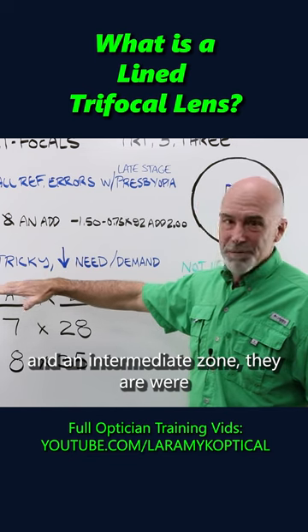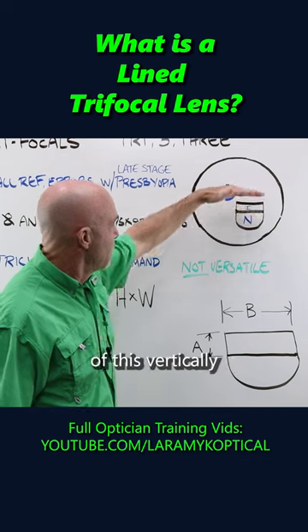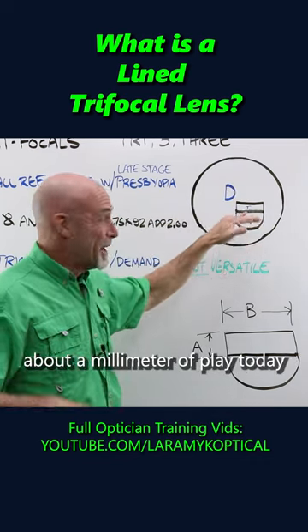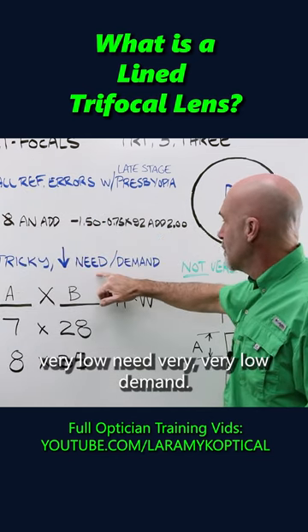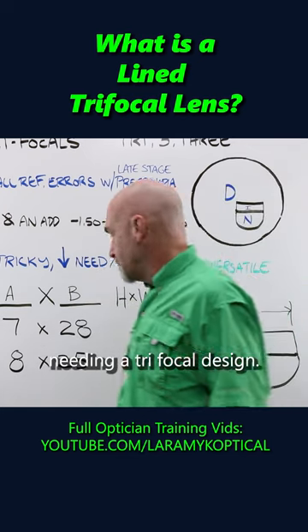They were — more like it — tricky to work with. The positioning of this vertically in relationship to the eye: on a good day you had about a millimeter of play. Today, very low need, very, very low demand. There are a lot of ways around needing a trifocal design.